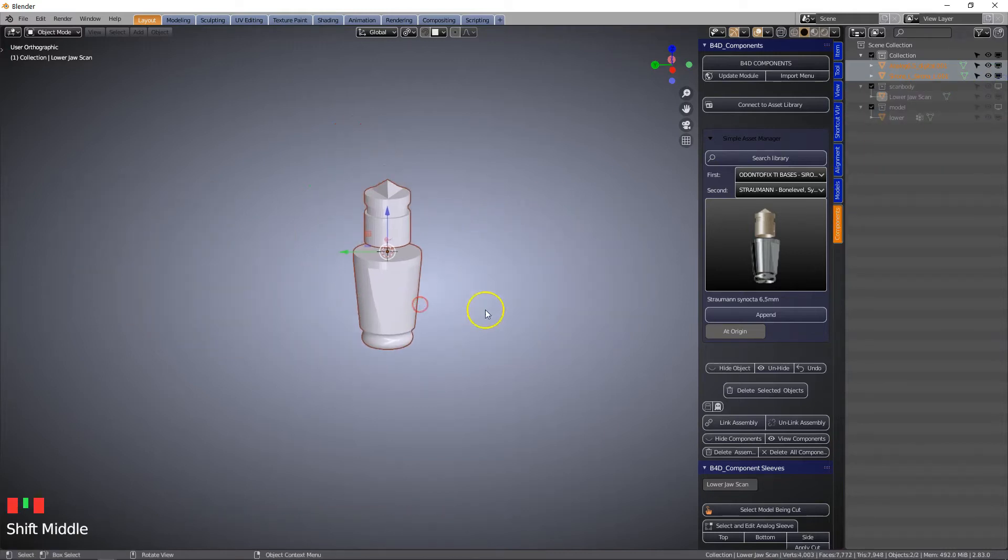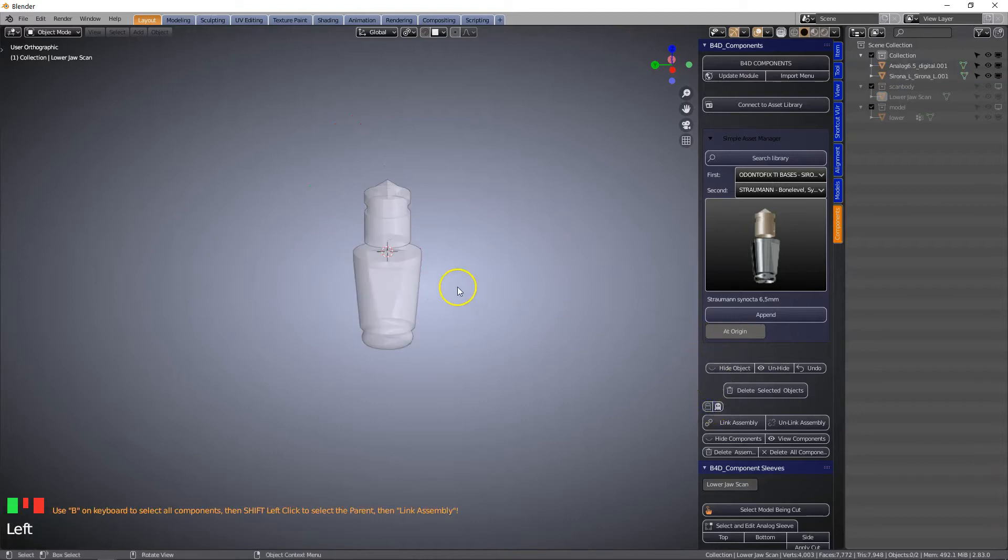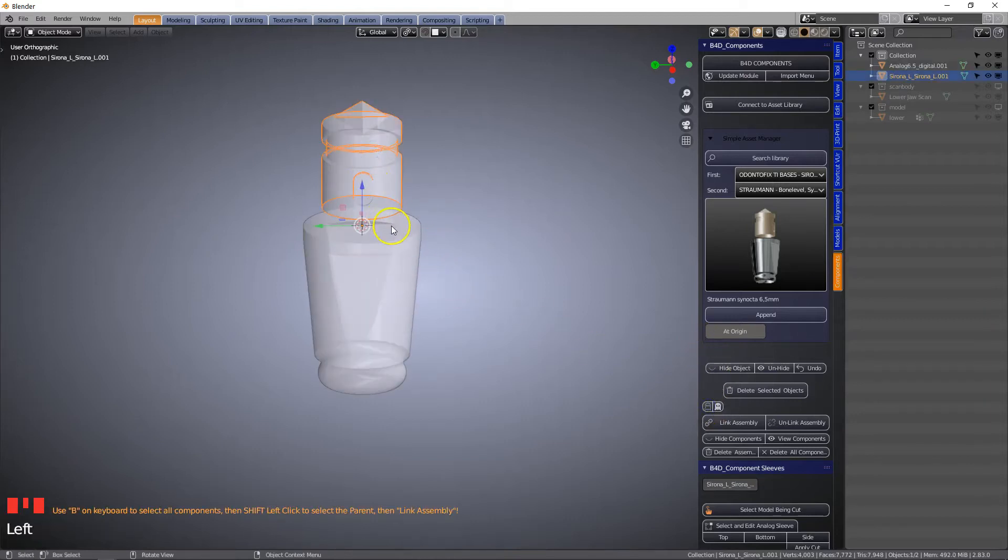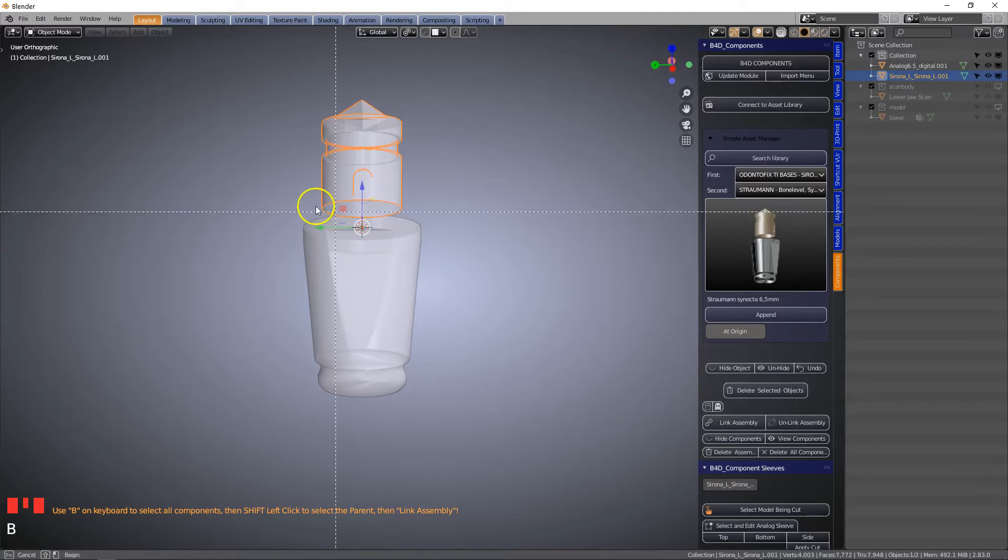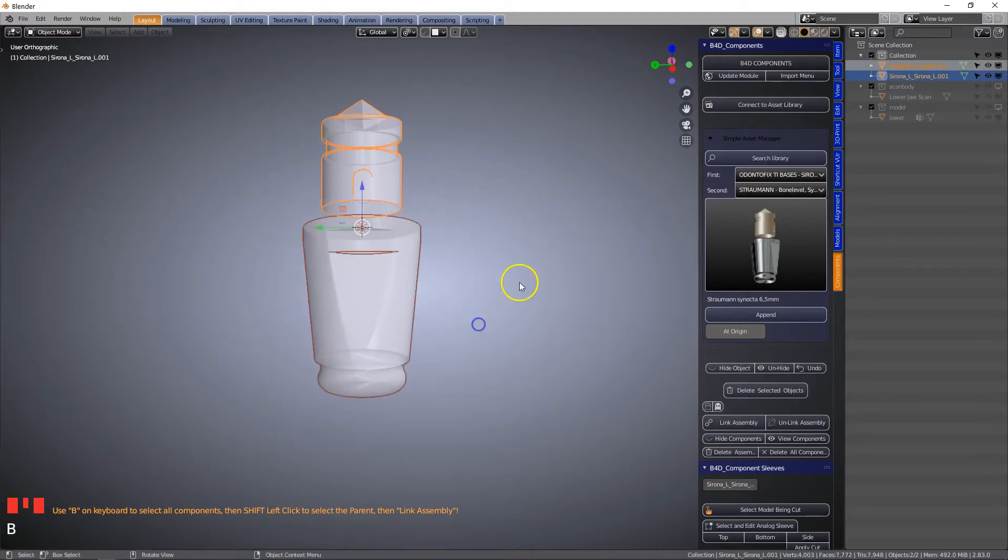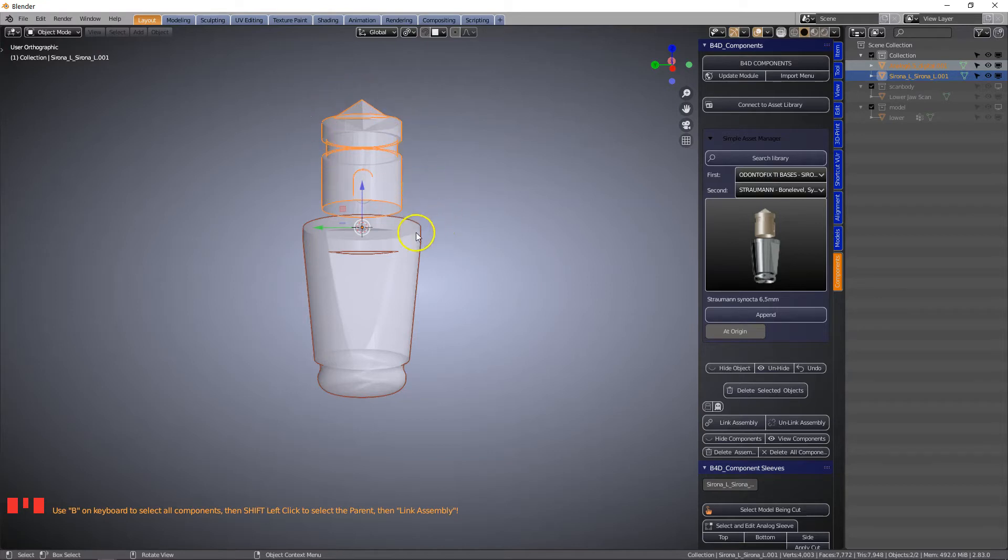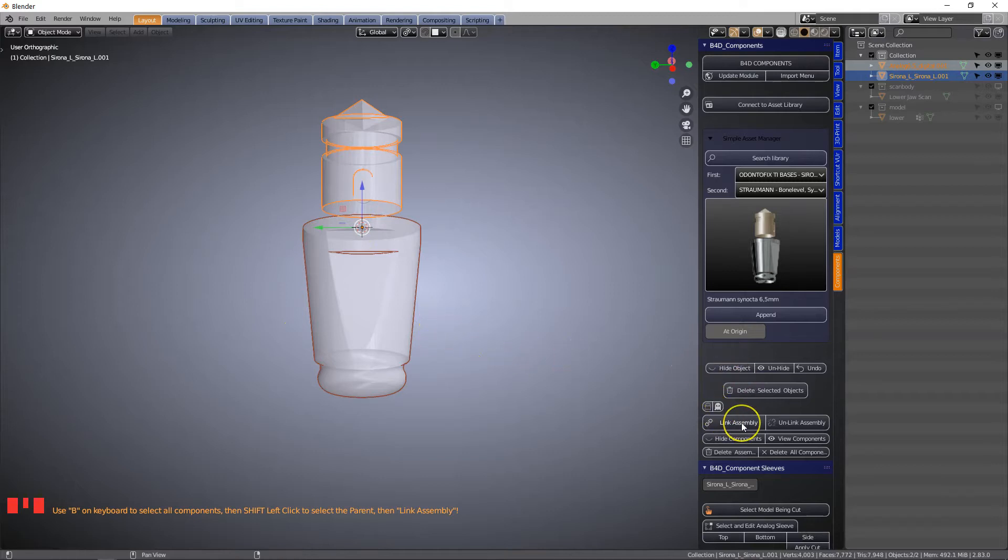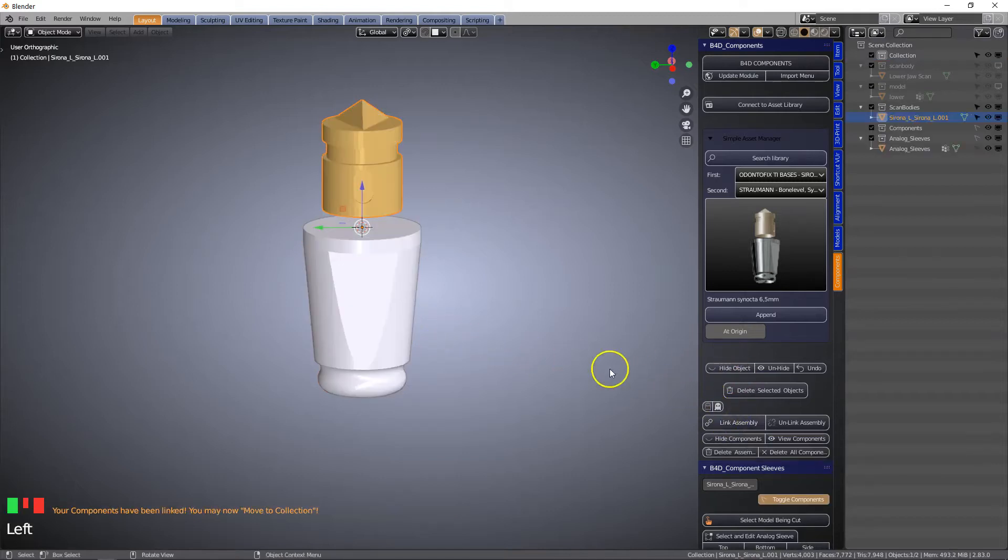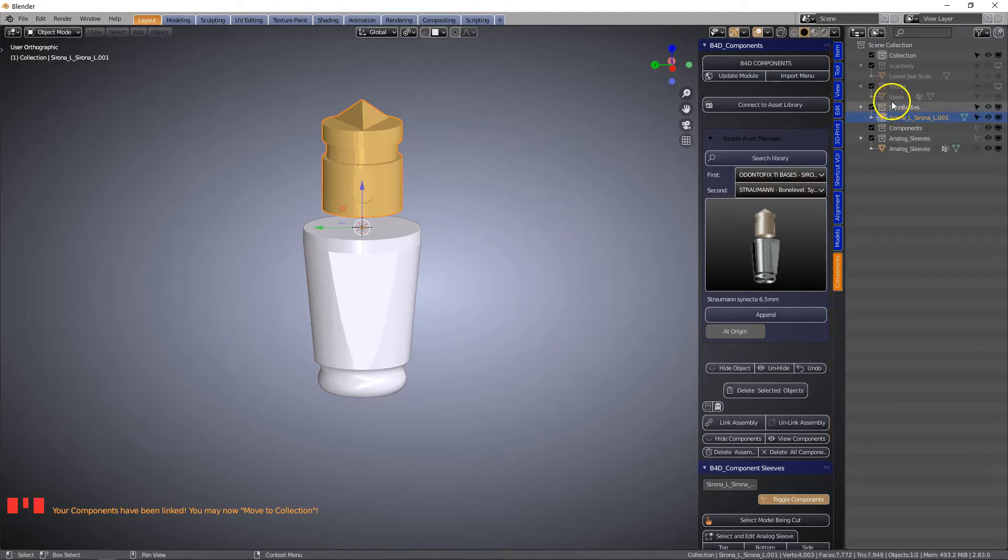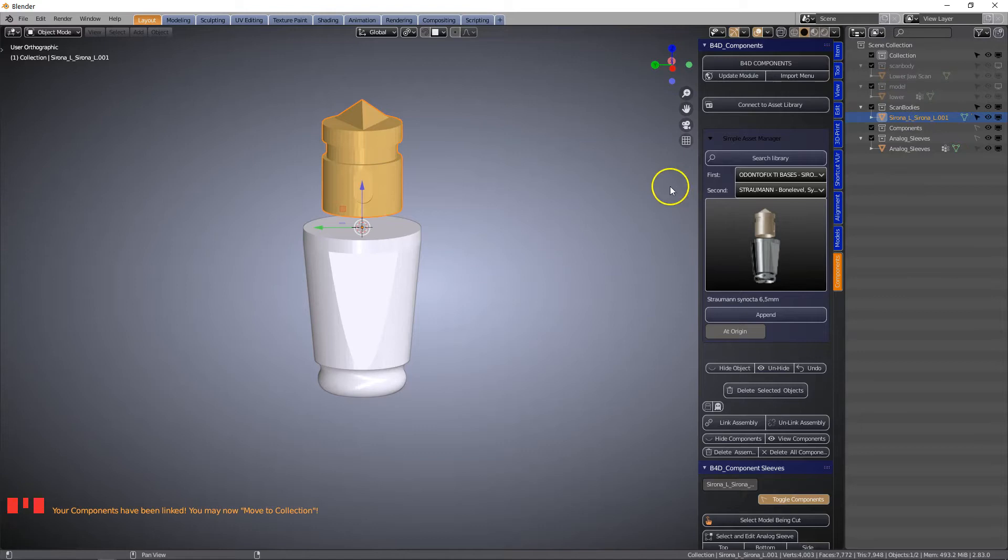Then we're going to go into transparent mode and always select the scan body first, and then using the B key we can select the rest. The first one selected and all the other ones follow that. Then click link assembly. This will link them and put the components into special collections.